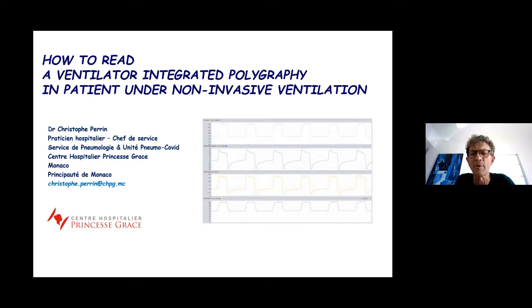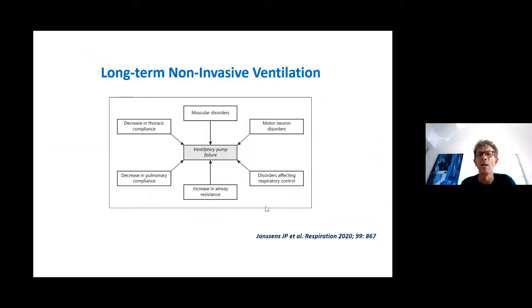The purpose of the presentation, as you can see on the title, is how to read the ventilator integrated polygraphy in a patient under non-invasive ventilation.